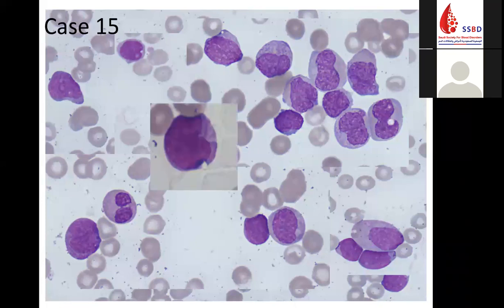So what do you think after looking at these cells? Acute leukemia? Is it lymphoid, myeloid? Okay, someone here is saying a biphenotypic acute leukemia. Definitely we need a flow. Most of the maturing cells here are granulocytes. MDS, AML, good differential, if the patient is documented to have an MDS before. So acute myeloid leukemia with MDS-related changes could be. So it looks like myeloid leukemia. However, you need your immunophenotyping by flow cytometry.